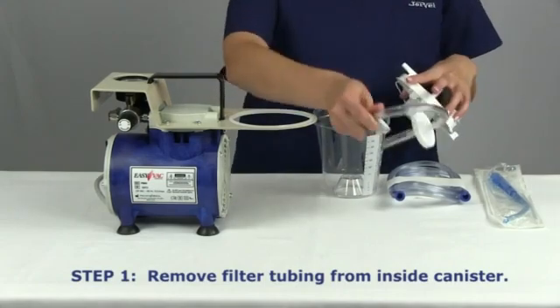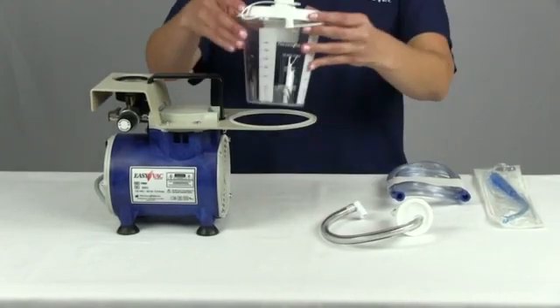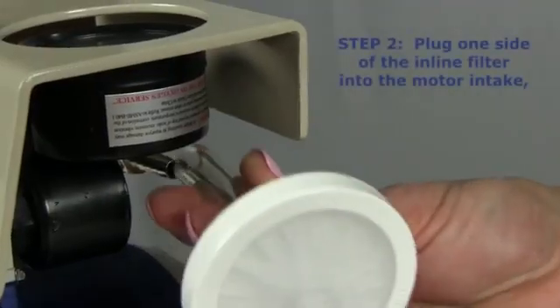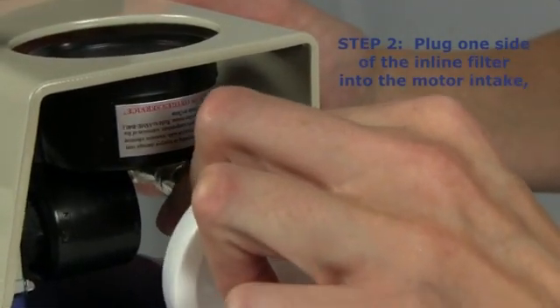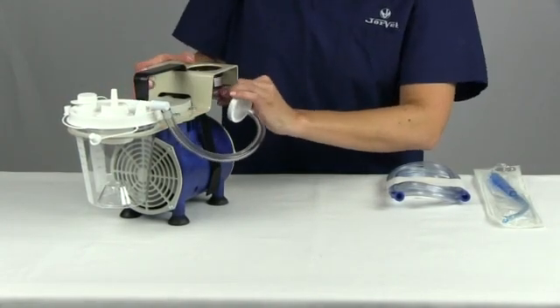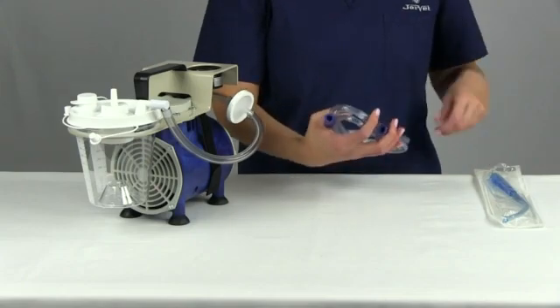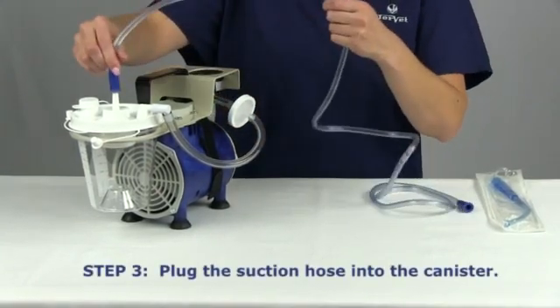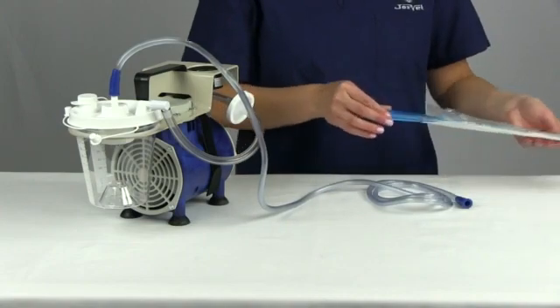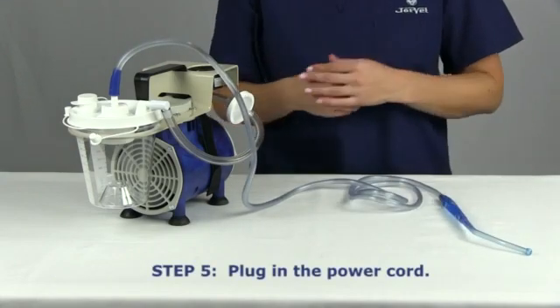You'll find the in-line filter stored inside the canister. Plug one side into the motor intake and the other into the canister itself. Take your suction hose and plug one side into your canister and leave the other side free to connect your suction handle. Next, you will plug in your suction handle into the end of the suction hose. Plug in your power cord and then you're ready to go.